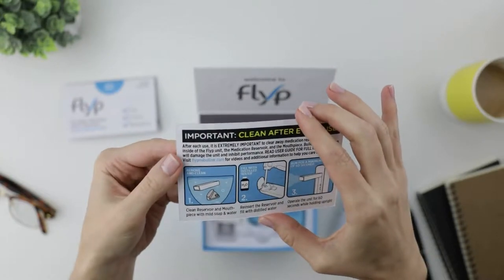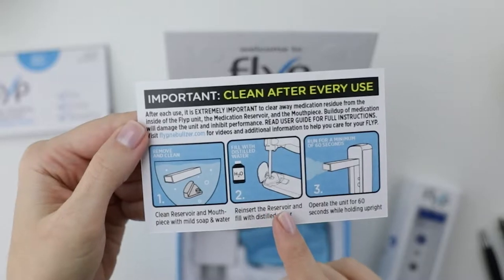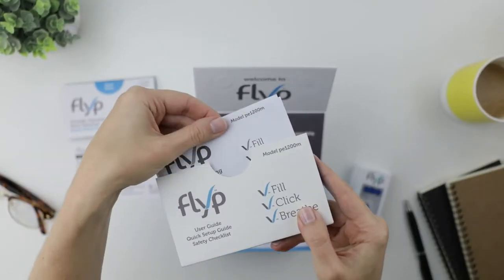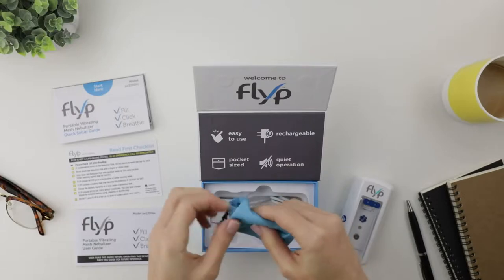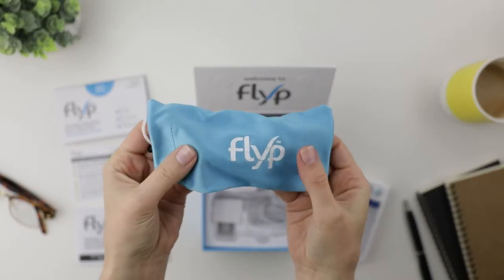Now it is critical to clean Flip after every use, but how easy is that? So much easier than cleaning my old nebulizer. Can you tell I'm obsessed with how easy this is to clean? And here's the deep dive — everything you need to know about using Flip. Cool blue bag, great for my purse, briefcase, or backpack. Very soft.